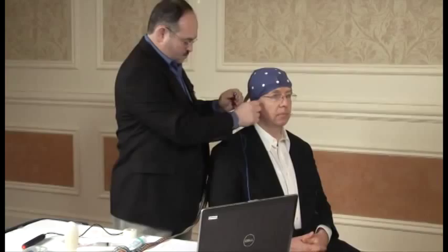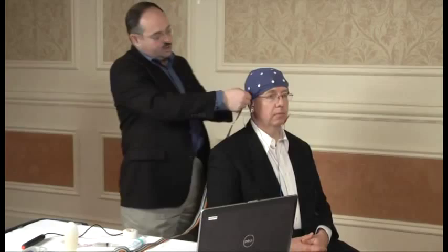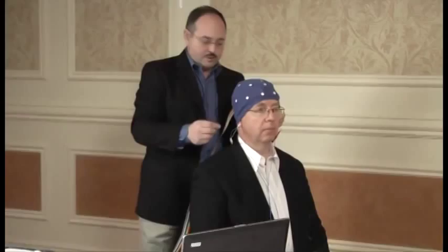You can also place the earbuds in at this time. In some cases, you can allow this flap from the cap to hold the earbuds in place. There's also a patient response button, and you put it in the dominant hand of the patient. If they're right handed, it goes in the right hand. Left handed in the left.